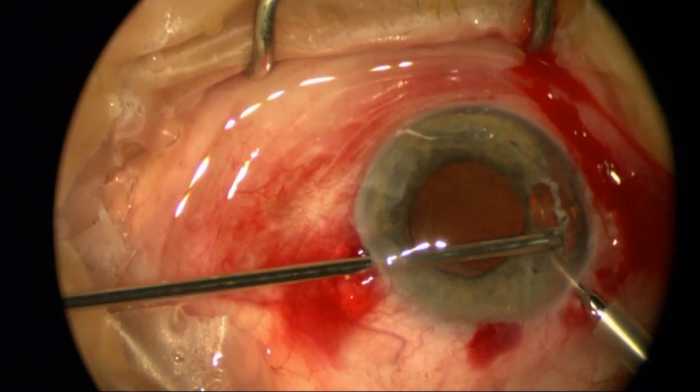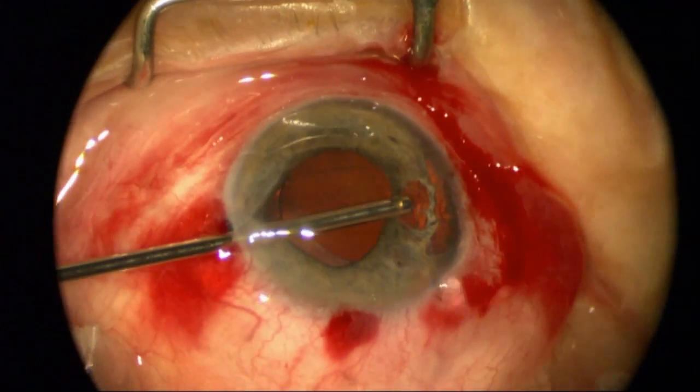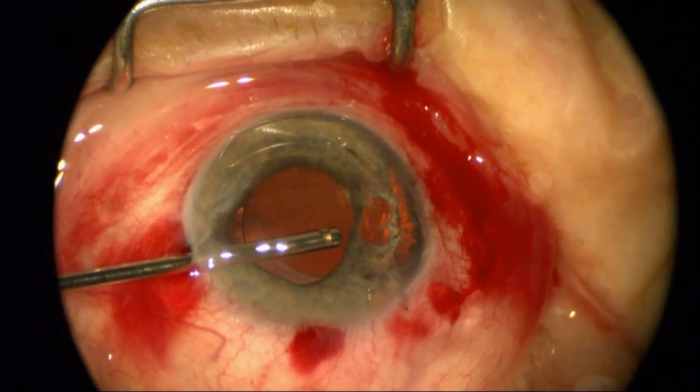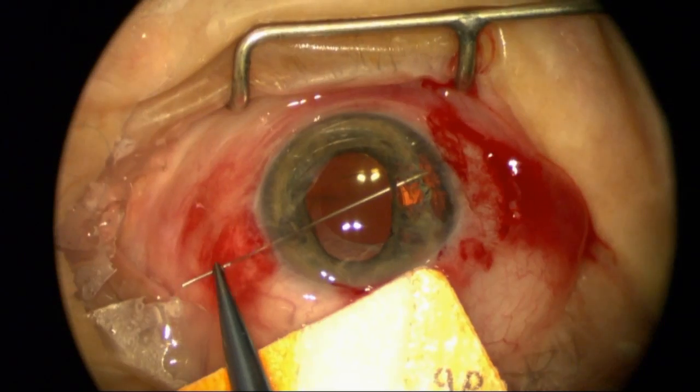Here I'm putting in more viscoelastic and removing vitreous that's coming around some of the injured area, which also has some zonular weakness. I didn't need a capsular tension ring, but I was ready to use one if needed.